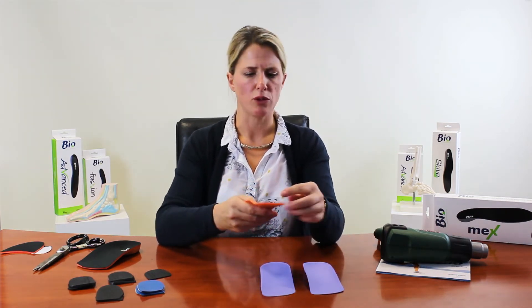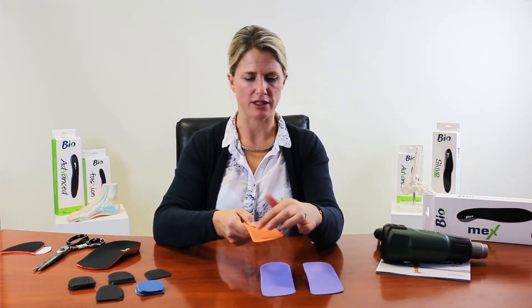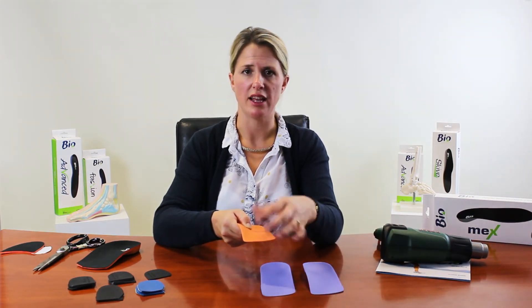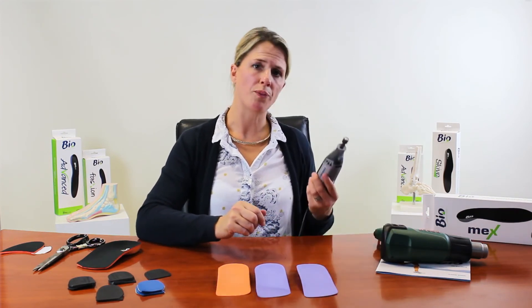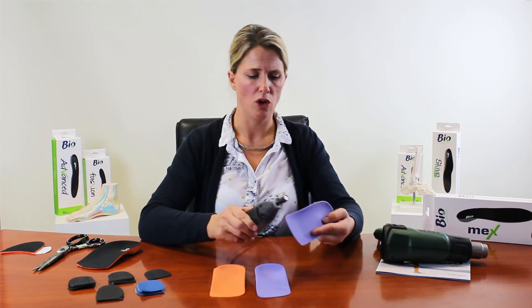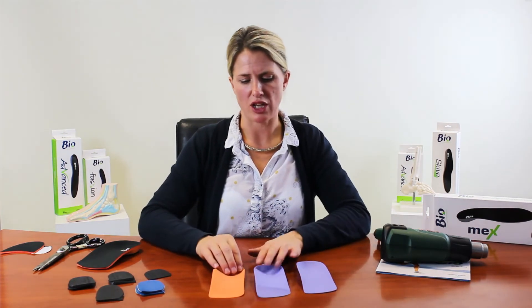If you want to cut little bits out — first met cutouts, or under the second, third, fourth, or fifth metatarsals — heat mould that area first and then cut it; it cuts almost like plasticine, making it much easier to work with. A Dremel, which many of you have in clinic, also works very well for grinding out a first met cutout or grinding pieces off the side.